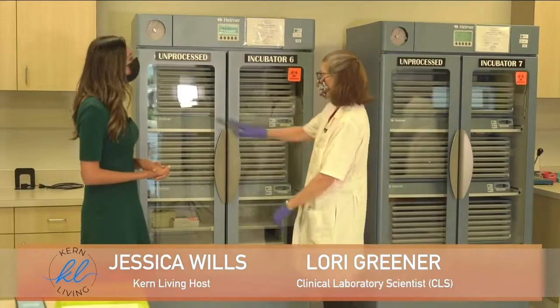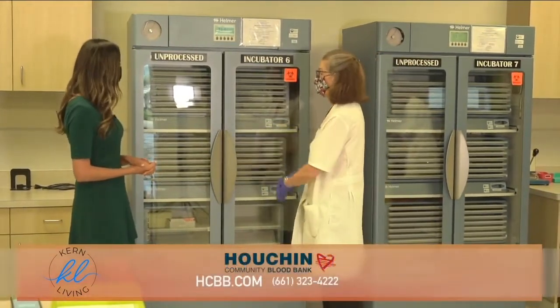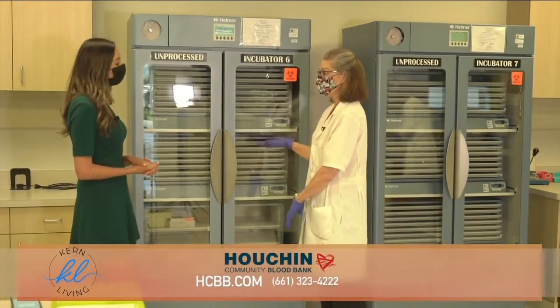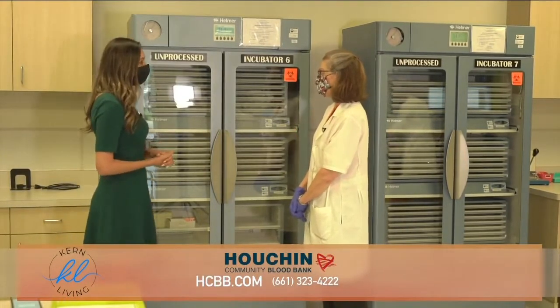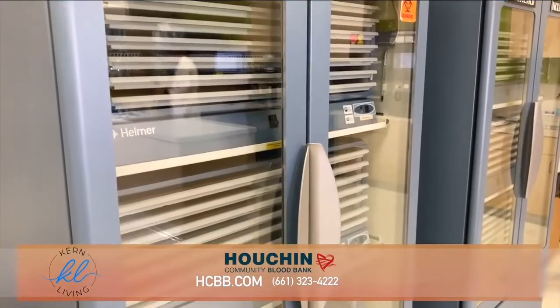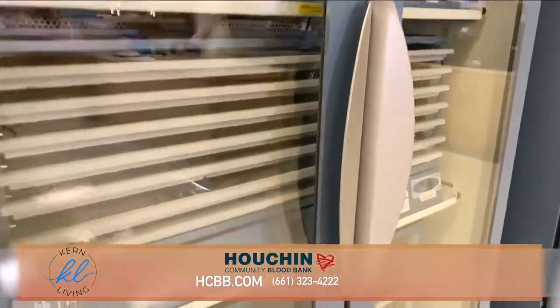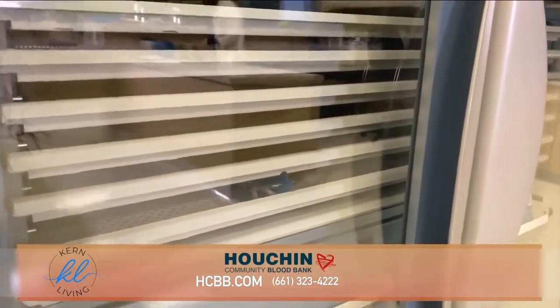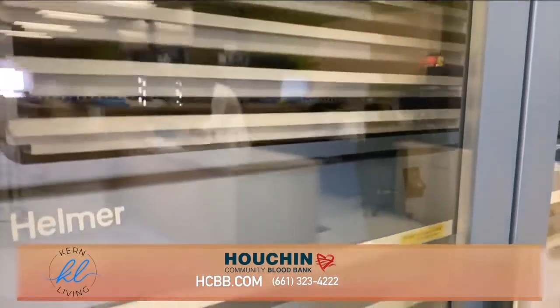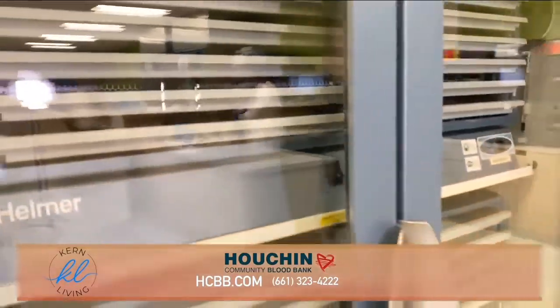All right, when the platelets come to us in the laboratory, we place them in the incubator where they're constantly in motion. They're stored at room temperature. And that's important because they can't be refrigerated like red cells or frozen like plasma. And bacteria love to grow at room temperature. One of the main things that we do is we let them stay here and agitate for 24 hours. So once they're in here, then what do we do next?